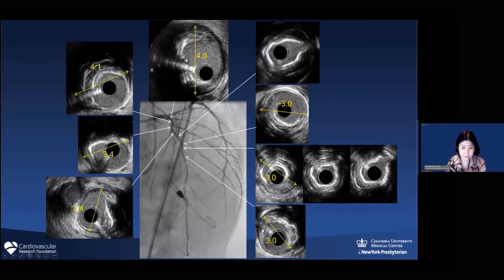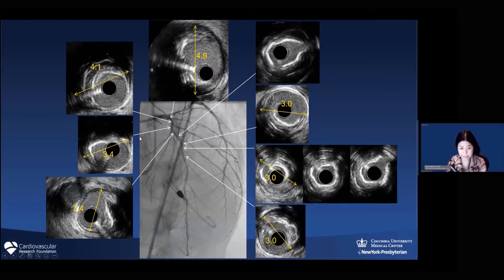Starting from the very proximal LAD, I measure media-to-media: 4.9mm. After the first diagonal, I measure 4.1mm. After the second diagonal, it's 3.4mm. After the third diagonal, I measure 3.0mm. And without branch takeoff, the vessel diameter is similar.